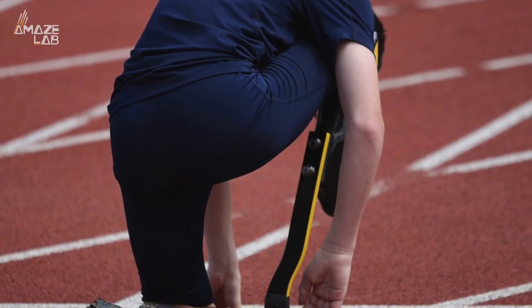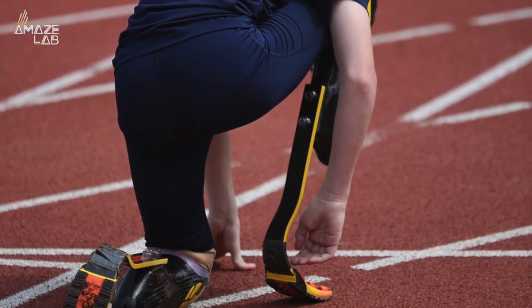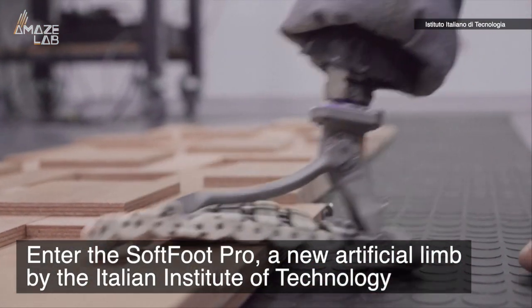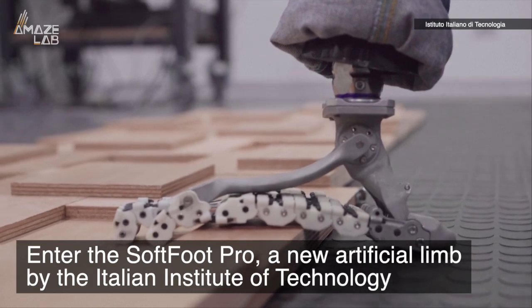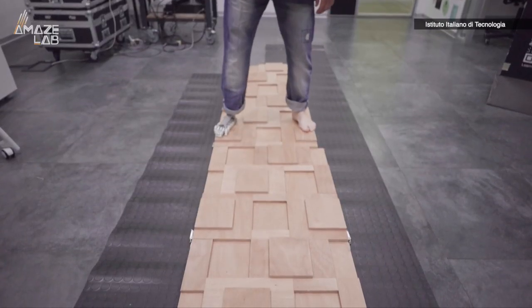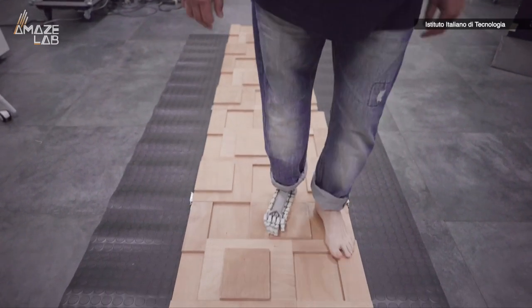Prosthetic limbs have come a long way in recent years, but most of their iterations, especially with regards to feet, have gone for function over form — and so enters the Softfoot Pro, a new artificial limb by the Italian Institute of Technology. It has a soft body mimicking a real human foot, one its developers say is not only more complex than the hand, but which also helps humans deal with every environment.